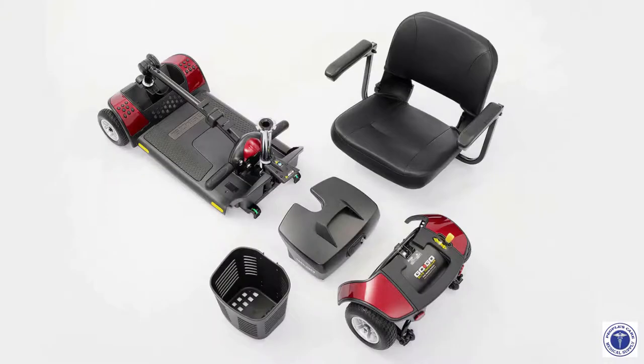You can disassemble the GoGo Sport into five pieces: the seat, the front section, the rear section, the battery pack, and the front basket.